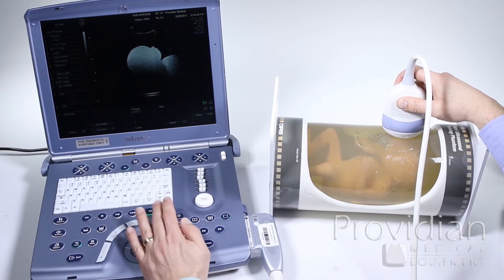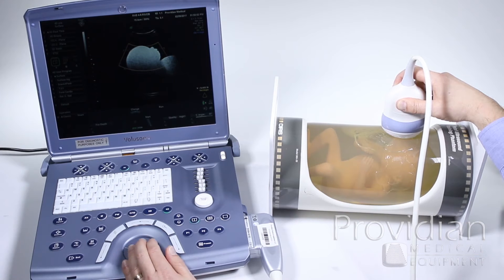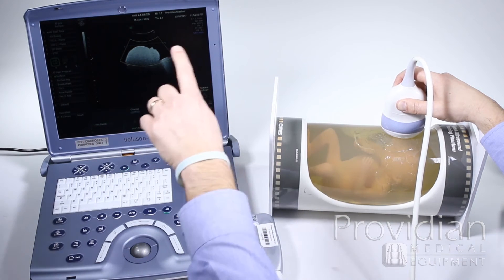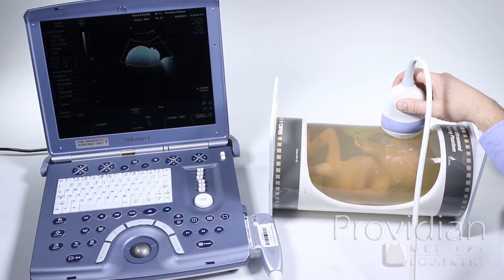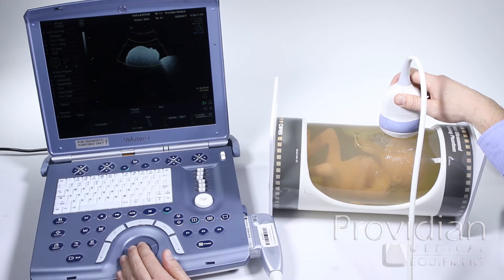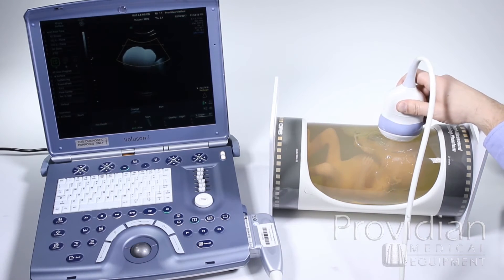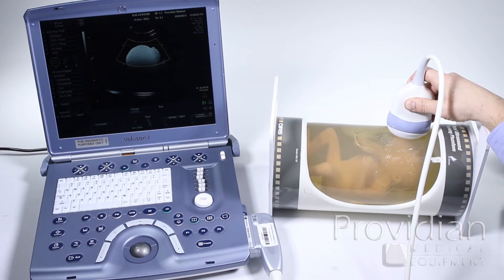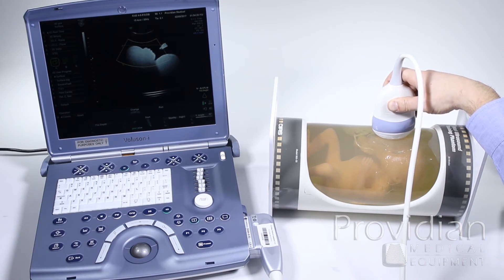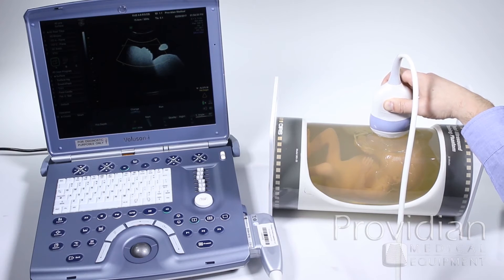Once we have this, we're going to get what's called a region of interest box. Press the 4D button and it gives us this region of interest box. This green line at the top and the yellow box around it asks: what are you looking to image? If there's placenta in the way, you can put that green line between the face and whatever's in the way — try to get that green line as close to the face as possible and as parallel to the face as possible. If that nose, chin, and head are mostly parallel to that green line, that will give you the best image of the face.